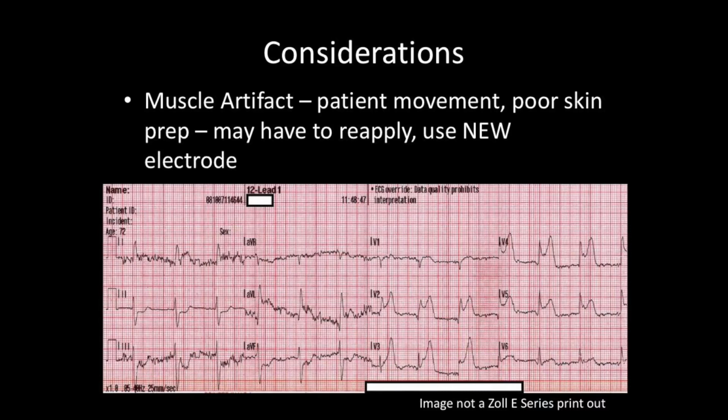Understood. But what I'm trying to say to you is, this doesn't matter, what you think doesn't matter, send it. Their problem, not our problem. So that's the other theme I want you to understand: we're going to do the best with acquiring a 12 lead, we're going to do it as fast as we can, we're going to do it appropriately, and we're going to send it. And then the rest, not our problem, their problem, okay?